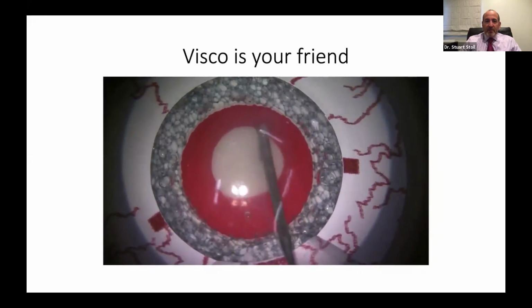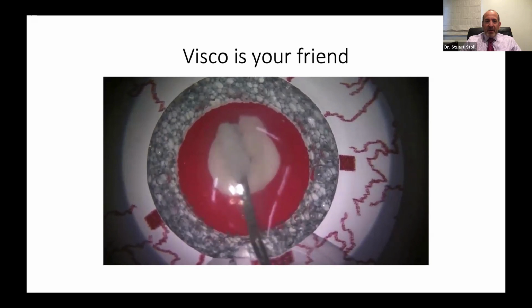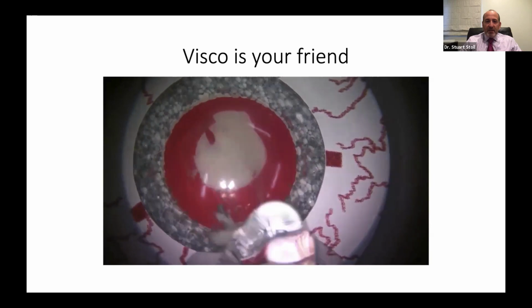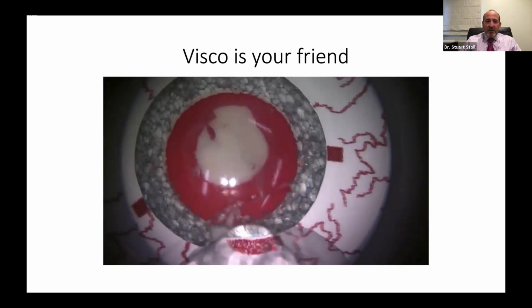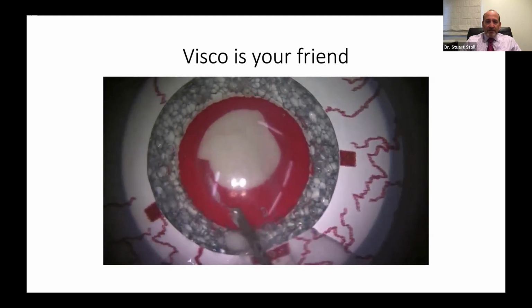So here's a case where we had too small of a rhexis. We're reinitiated with the scissors. Now we're grasping it. Look, I've gotten down into the cortex. I've fluffed it up. It's hard to see. Take a second, put some viscoelastic in, clear your view, and then continue on around.